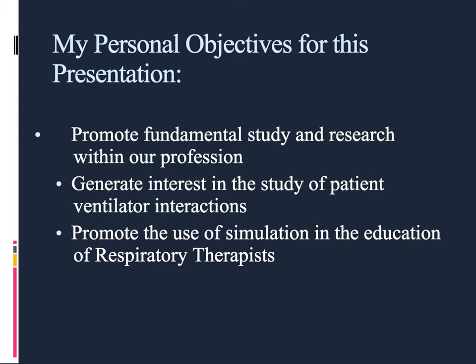I do have my own personal objectives for this presentation, in that I'm hoping to encourage other respiratory therapists to do some fundamental research within our profession, to look at different devices and study patient ventilator interactions so that we can define what modes and what is the best settings for each individual patient. We should be experts in this area.